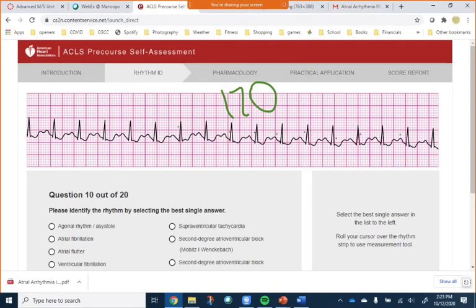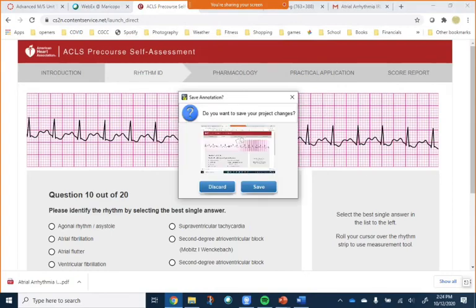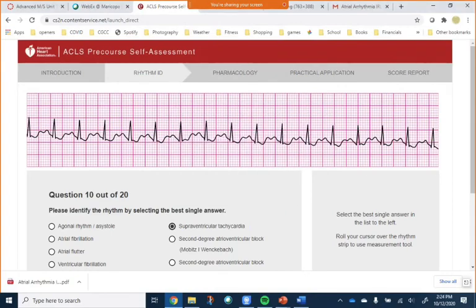So it's either in the atrial category or, I would probably call this for you, I'm telling you anything greater than 150 an SVT. I'm not sure if they're going to want you to call this one a sinus tachycardia or not. Let's see what they ask. We'll call it an SVT.